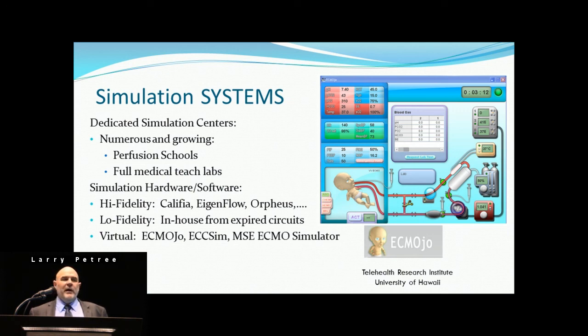But if you've got expired circuits that you can't use on a patient, don't toss those out. Set them aside and have a sim day. Practice things that maybe didn't go well on a case that you were losing a little sleep over. How could I have done that better? Practice an emergency of a filter plugging or an oxygenator issue or something like that.